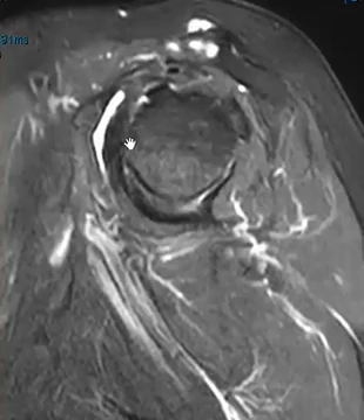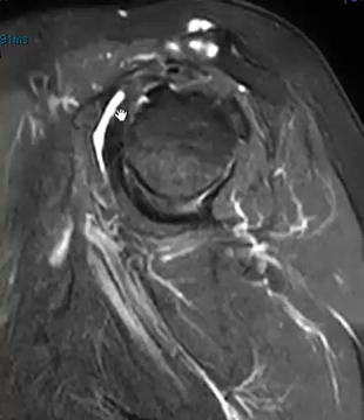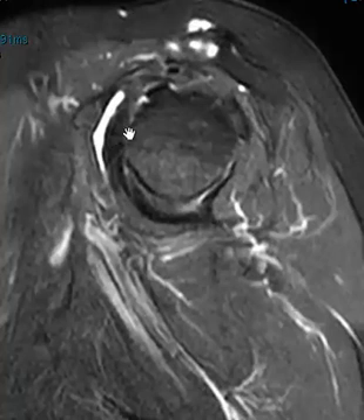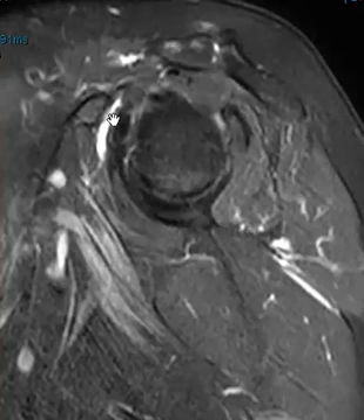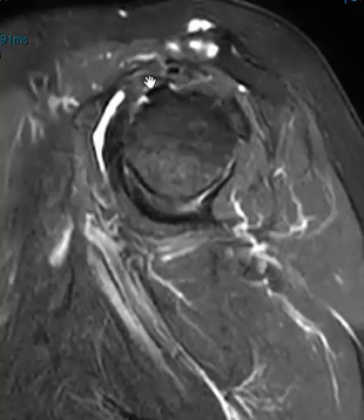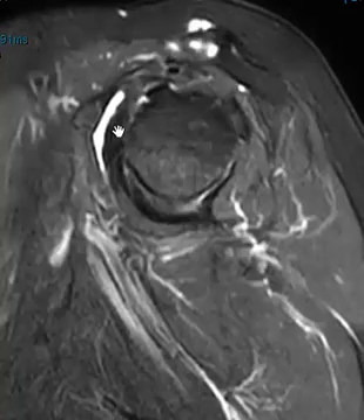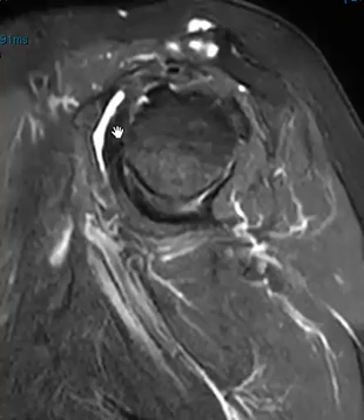The other thing we notice is there's this fluid collection, which is absolutely abnormal, here in front of the subscapularis. Right between the coracoid process and this subscapularis tendon is the subscapular bursa. So this is an acute bursitis. Now oftentimes you see fluid right here, but it doesn't go down so low — it's usually part of a joint effusion and the fluid protrudes anteriorly beneath the coracoid process. We call that fluid in the superior subscapularis recess. So it's just a joint effusion that looks very similar to this, but here we don't have fluid in the joint — we see it right here along in front of the subscapularis. This is a subscapular bursal effusion, acute bursitis.